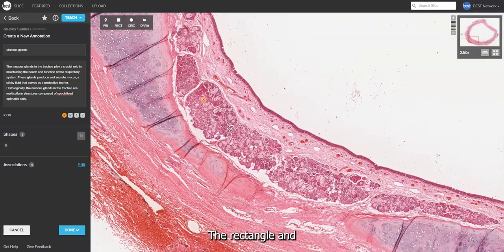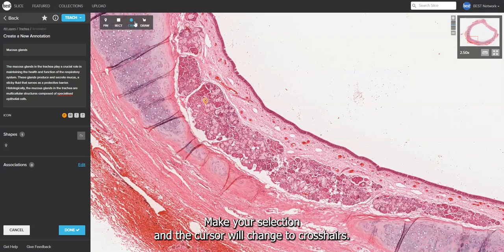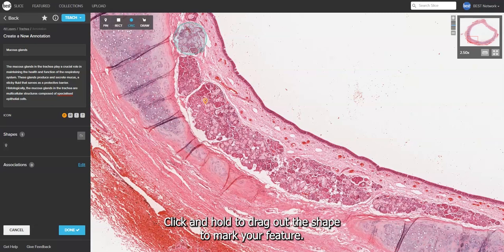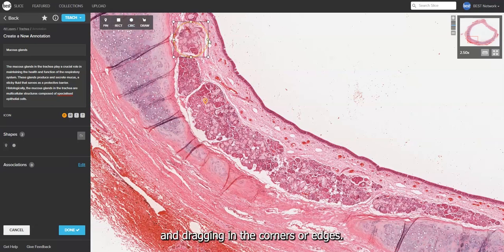The rectangle and circle tools work in the same way. Make your selection and the cursor will change to crosshairs. Click and hold to drag out the shape to mark your feature. Release the cursor to finish. Edit the shape by clicking it and dragging the corners or edges.